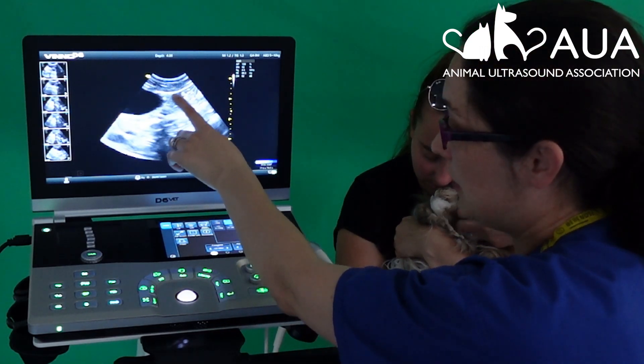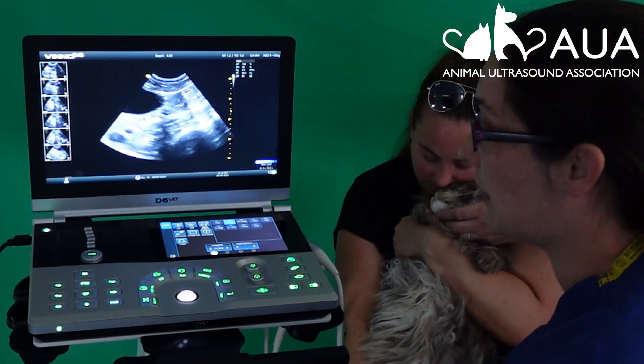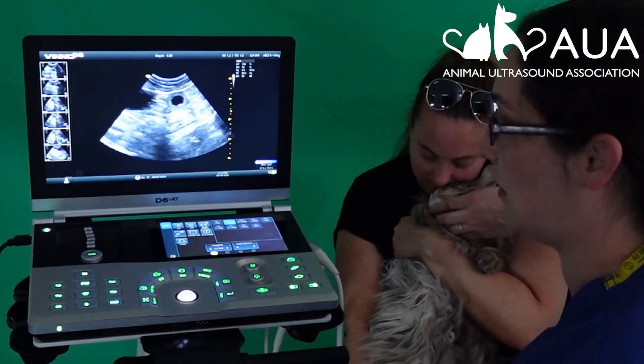The appearance of the uterus here — this is how it would appear if she was just coming in or out of season. But in Luna's case, a slight movement of my wrist and I can open that out to see that there is fluid inside.